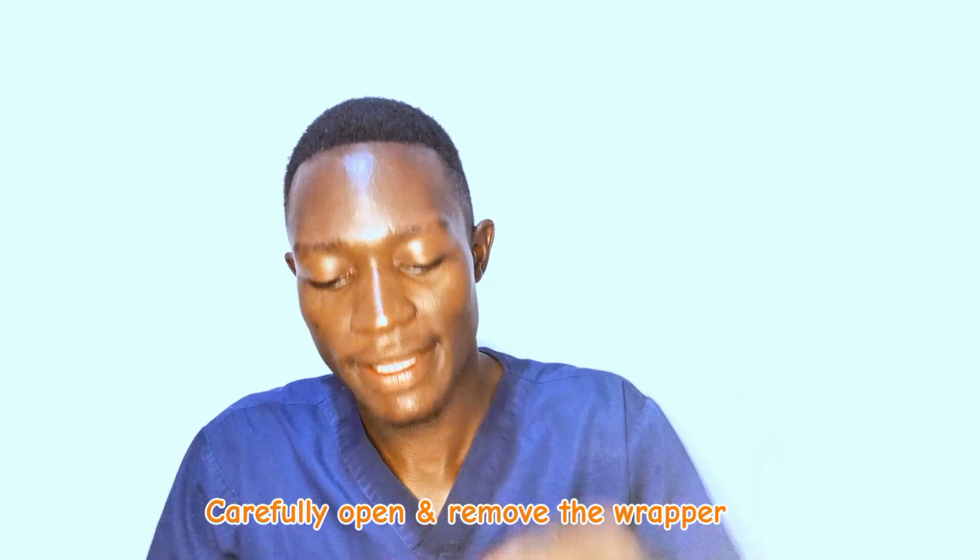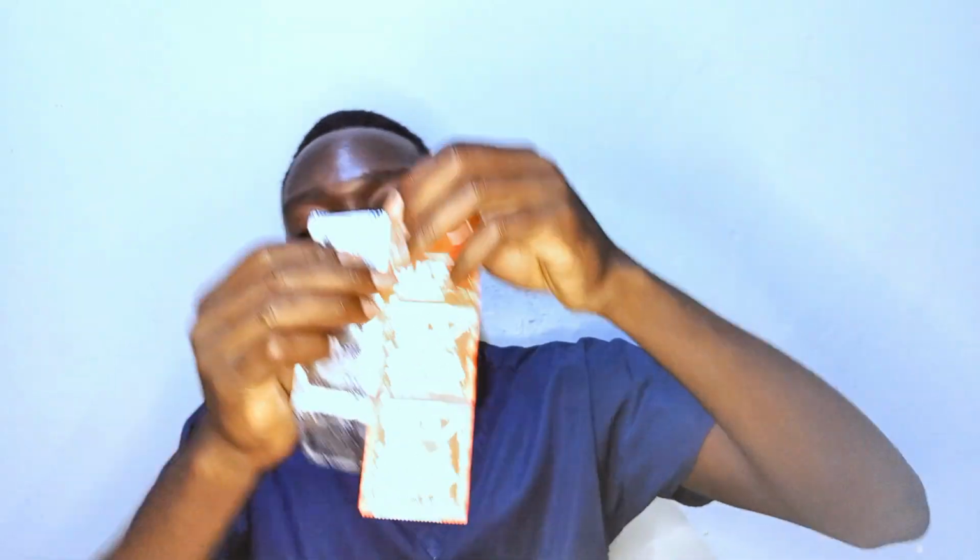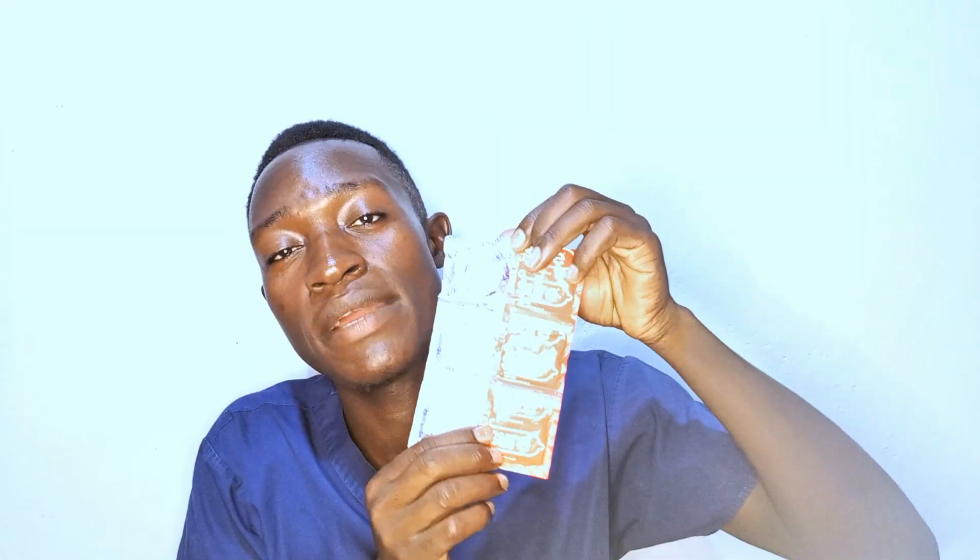So the second procedure is to carefully open and remove the wrapper. Carefully open the wrapper, the outside package where the condom is stored. You should not use your teeth. Do not do like this. Most people use their teeth to open the condom, but you should not use your teeth to open the condom. Also, if you have long nails, be careful while opening the wrappers, because your nails might tear the condom.